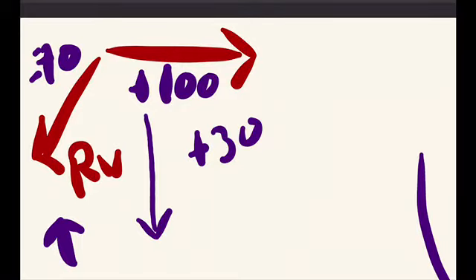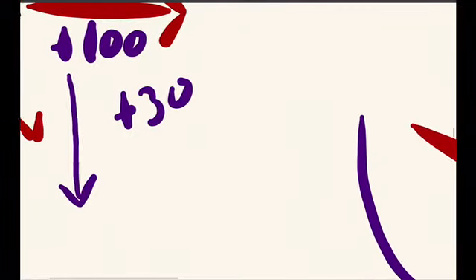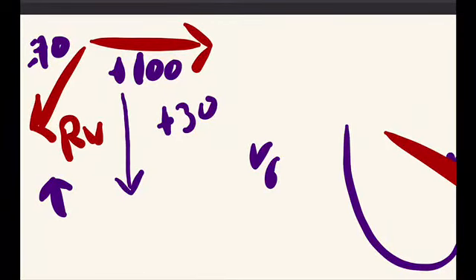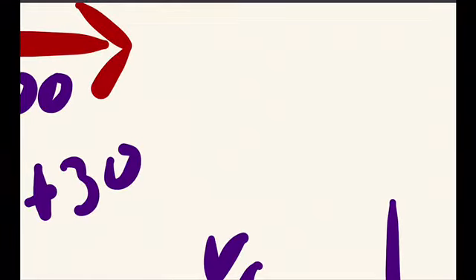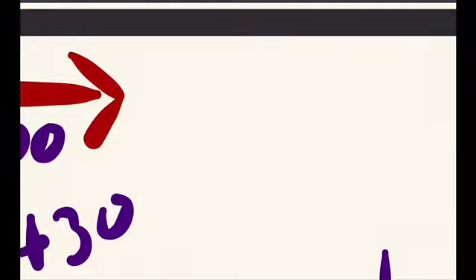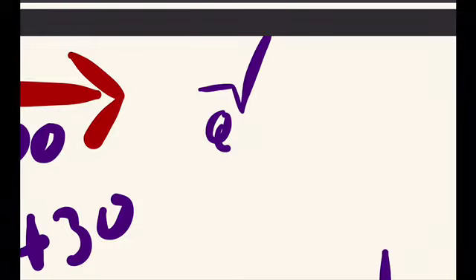Okay, so now the lead which was looking towards this ECG, the V6 lead. First, the vector was directly going towards the V6 lead. So if I draw the ECG which is obtained from V6 in a normal ECG, this is the Q wave. The Q wave is because of the septal depolarization, and that occurs from left to right, so the vector goes away from the lead V6. Now this is the R wave, and the R wave is because of the ventricular depolarization.